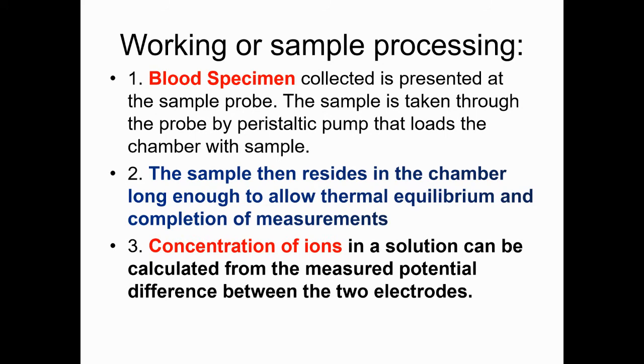After the insertion of the needle probe into the sample, the sample will be absorbed by the probe, and then it enters into the peristaltic pump with the help of the probe. After entering the peristaltic pump, it will load the chamber. Now the chamber will be fully loaded with the sample.